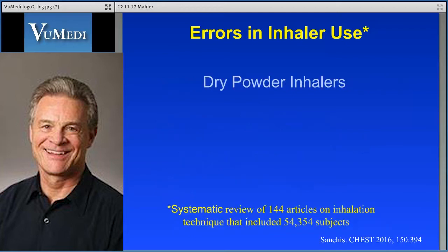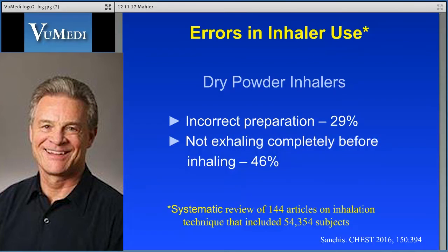There are also errors in dry powder inhaler use based on the same systematic review. 29% had incorrect preparation of the dry powder inhaler. 46% did not exhale completely before inhaling, and there was no breath hold in 37% of subjects.